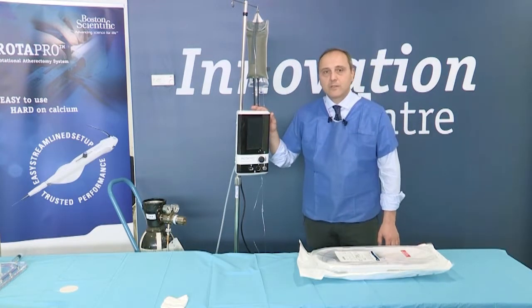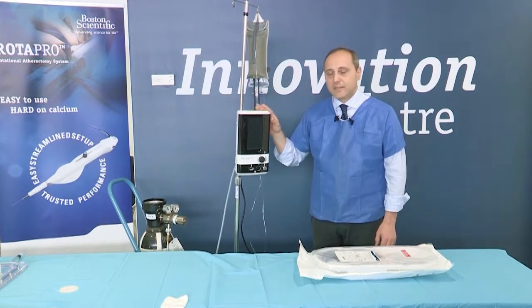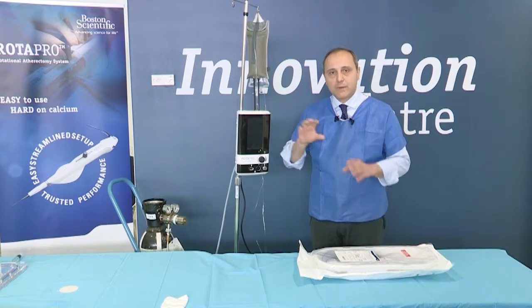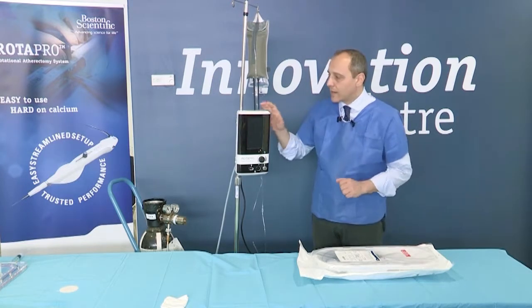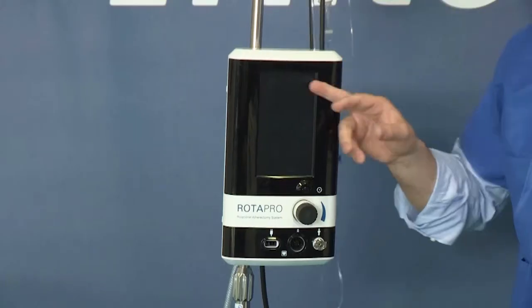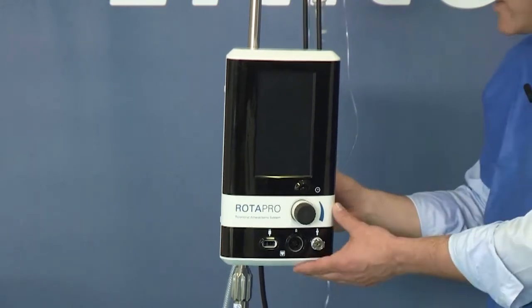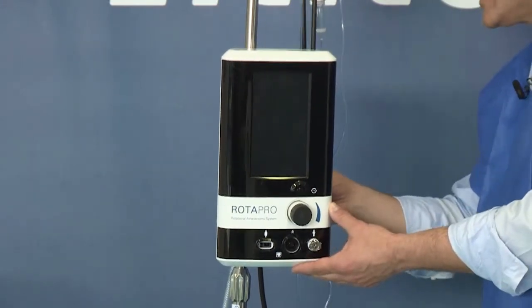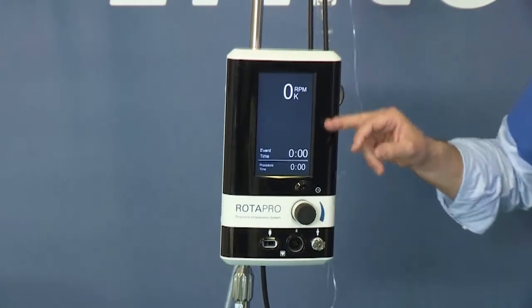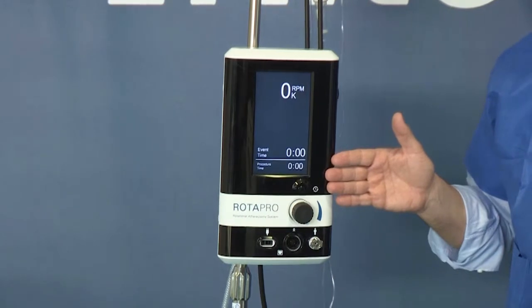The console is just on the pole. Please notice the fact that this console can be either used on a car, so placing it horizontally, or can be used on a pole, placing it vertically. So the screen that we will switch on now will just turn the information such that it can be read in a vertical position as well.